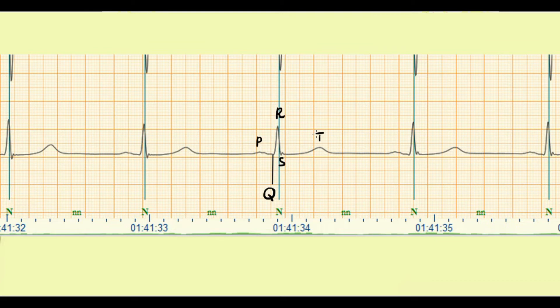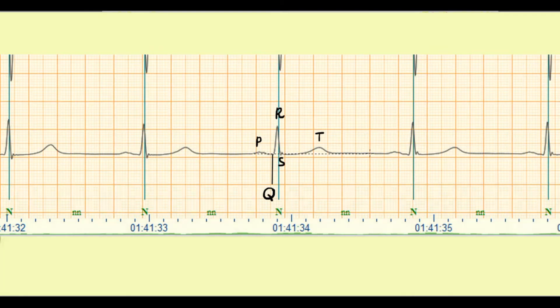When it is difficult to tell where the QT interval ends, use the tangent method. Firstly, let's draw the baseline according to the PQ segment.